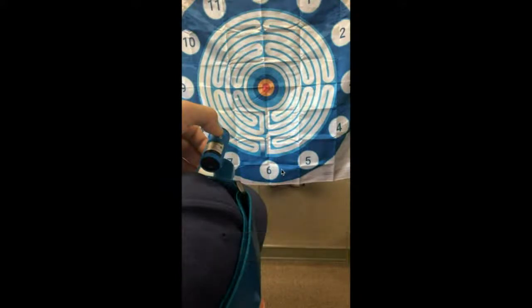So as I mentioned before, this has been completed in one of our previous live streams, but let's just review this real quick for those who weren't able to jump on that one. So inside of our clinician kit, we have this maze clock target that's included, and we standardize joint position sense error testing inside of this. We put it 5 feet away from the target.